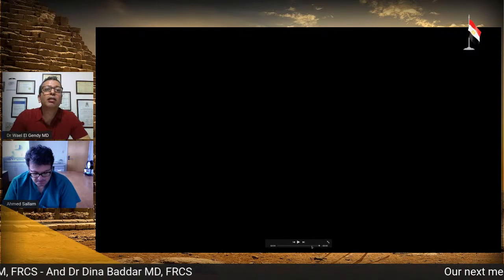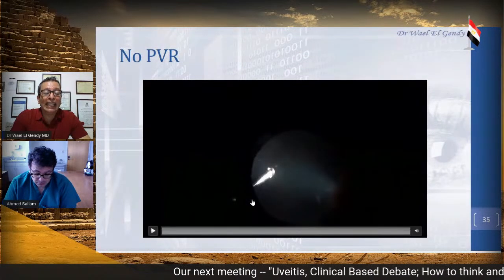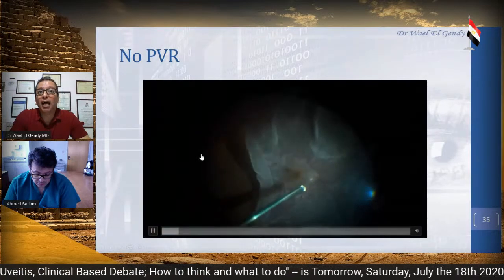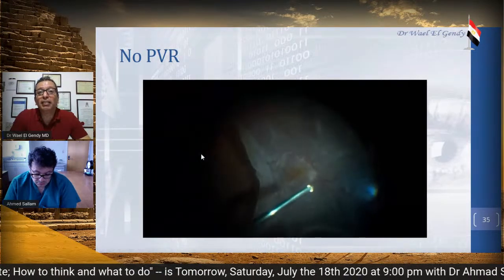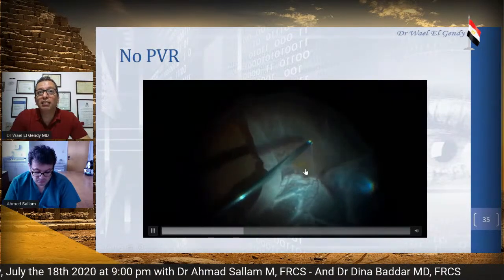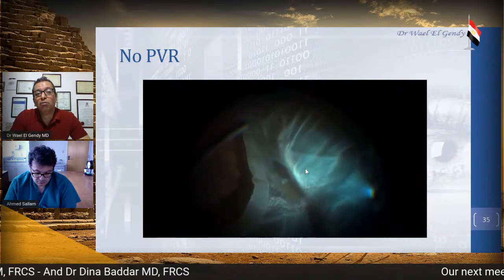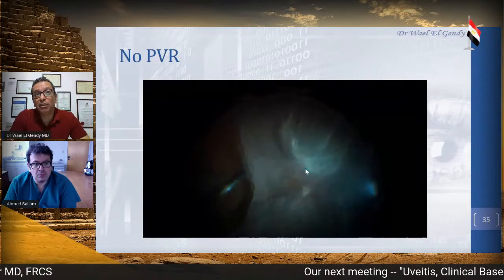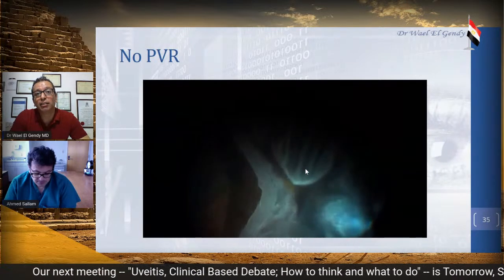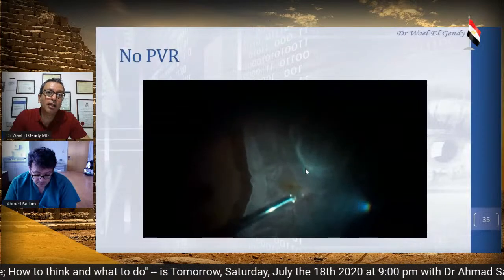What else do we need to talk about? Well, I have one video to show that although it's in the definition of giant retinal tear to have a PVD, sometimes you don't. In traumatic cases, or in myopic patients, you can see you're still trying to remove the posterior vitreous. So it's very rare, but it's there. You can sometimes find yourself stuck with the vitreous that you need to start pulling on and remove from the posterior retina.